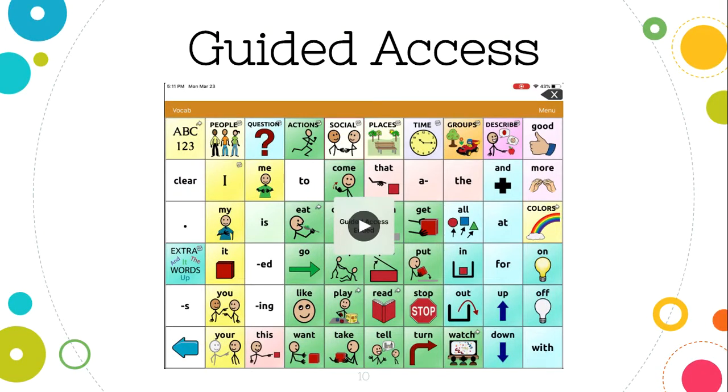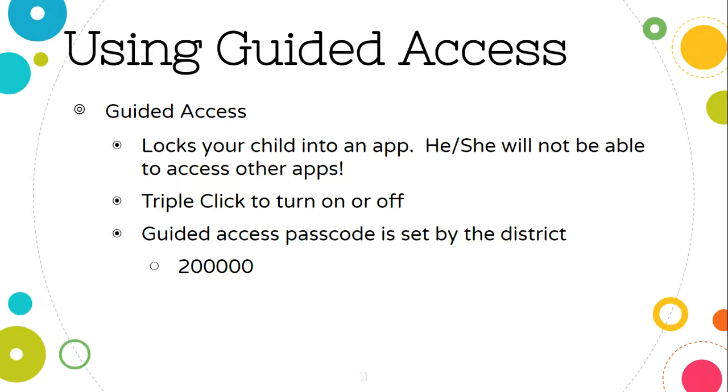So just wanting to talk to you about why we use guided access. So this iPad that your child is using is what we call a dedicated iPad for AAC. So the only thing that they should be accessing on that iPad is the communication app that they have. And there's a couple reasons for that. One, if we also have them accessing things like other educational apps or things like YouTube or Netflix, when they're in those other apps, they now no longer have access to their voice.